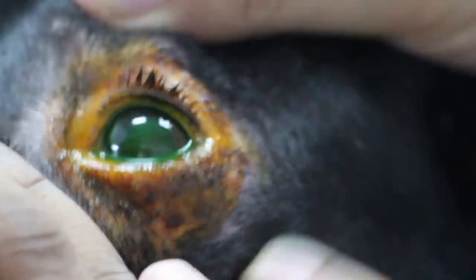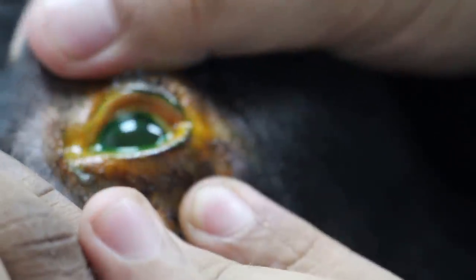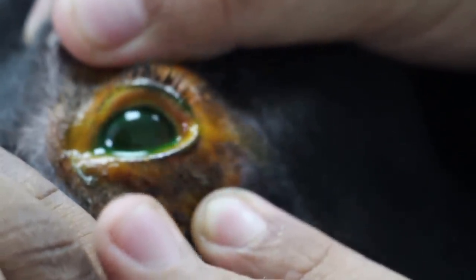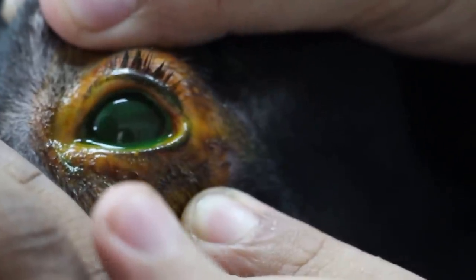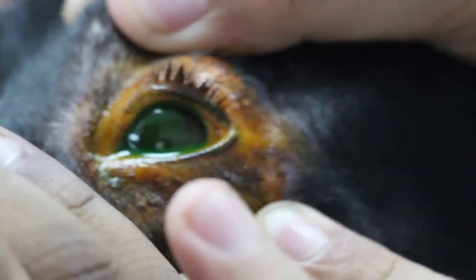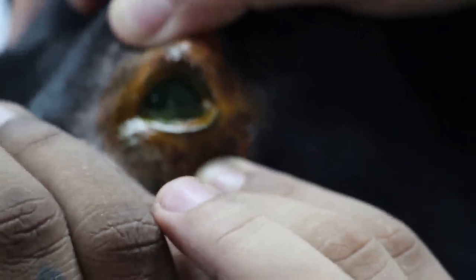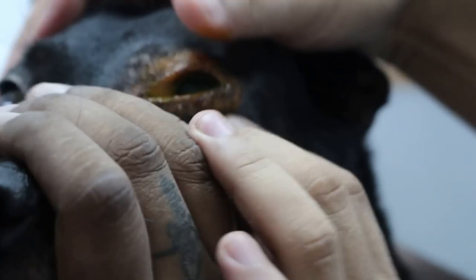Oh, centre there — a lot of green. A lot of green here also. A lot of green means this fellow, the whole eye, the cornea is injured. That's why the colour is green. Ok, shh — down a bit. I pull down the lower eyelid a bit.